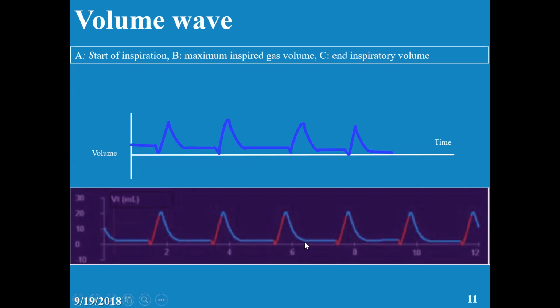But assuming this is not existing, what do you think the breath types? Is it mandatory? Is it spontaneous? Or is it assisted, and why? The other doctor said they are the same shape, so probably they are mandatory. What do you think?